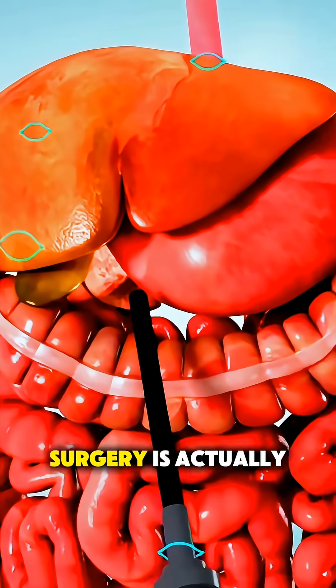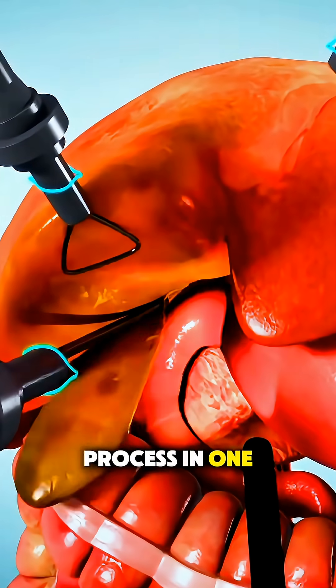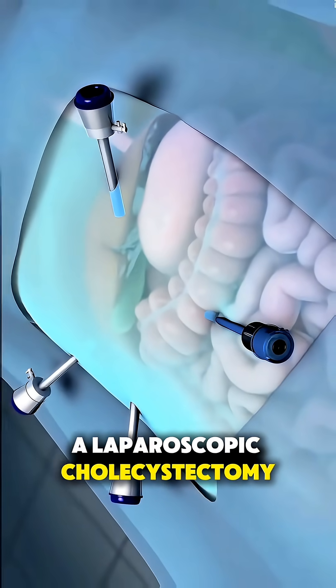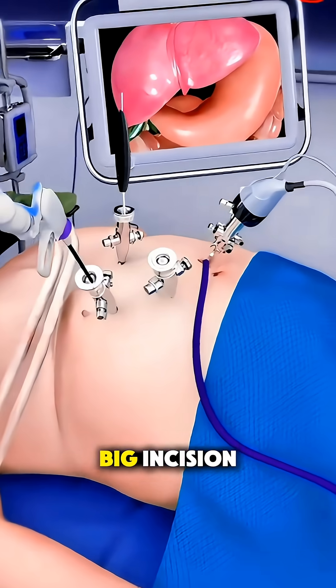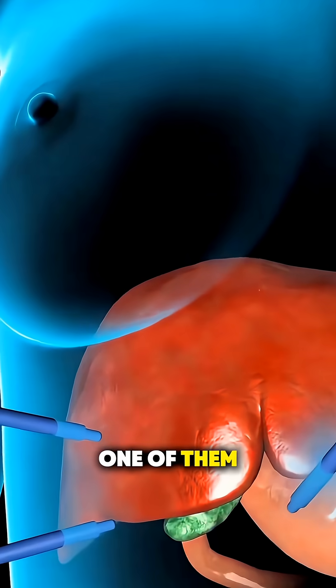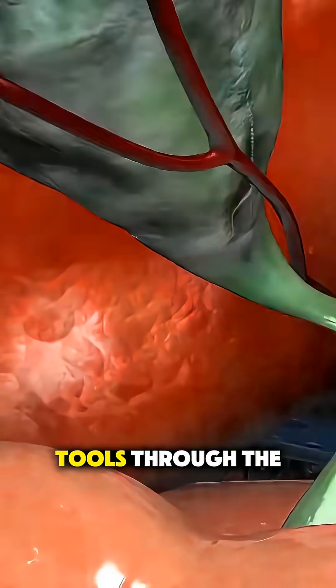Ever wonder how gallbladder removal surgery is actually done? Here's the whole process in one smooth, easy-to-follow breakdown. Most people get a laparoscopic cholecystectomy, which basically means the surgeon uses tiny cuts instead of one big incision. They start by making a few small openings in your abdomen, then slide a thin camera through one of them so they can see everything on a screen, and place special tools through the others.